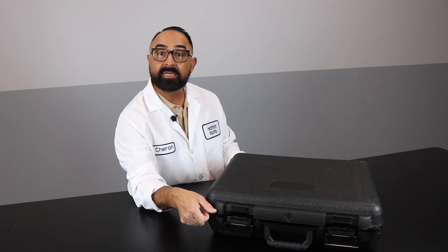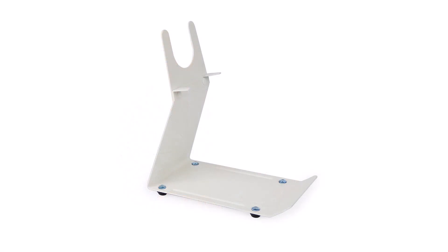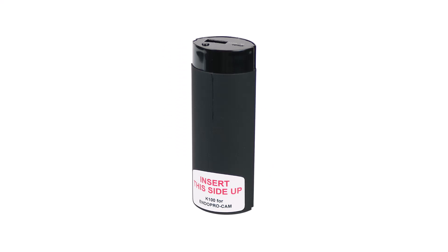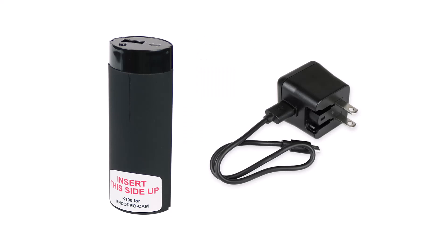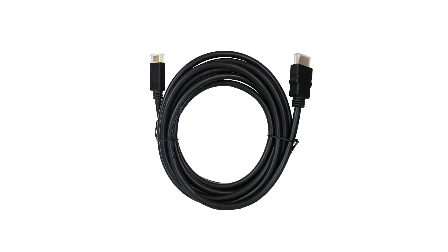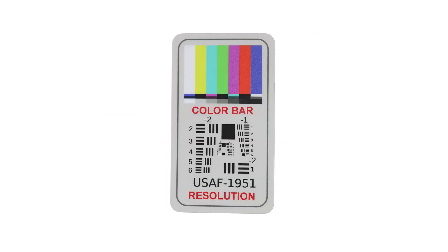When you receive your EndoProCam from Healthmark, you will receive it in a carrying case with all of the items inside. The EndoProCam comes with a stand, the EndoProCam itself, the coupler, a rechargeable battery for the EndoProCam, and the light source with the rechargeable battery inside. You also receive an extra battery for the EndoProCam with its charger. For the light source, an extra battery and its charger as well, the HDMI cable, and you also have the SD card as well as a test pattern.